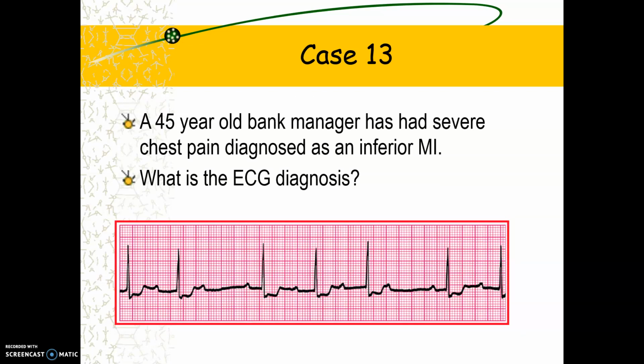Here's another patient with severe chest pain. If you look at this, first thing, without going into details, you just eyeball this and you can see missed beats in between. This is a rhythm with dropped beats. Drop beats usually represent some kind of second degree heart block. Let's look at the P waves. There are P waves, but not every P wave produces a QRS complex.